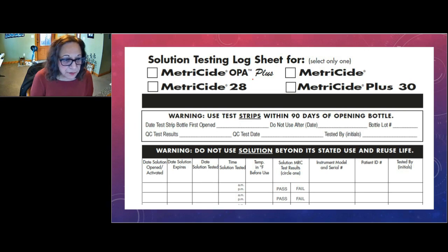I know there are some dental hand instruments that have a plastic coating on them, but I've seen those are actually safe for steam sterilization. As far as items made totally of plastic, I would check the manufacturer's instructions and see if they are single-use devices.